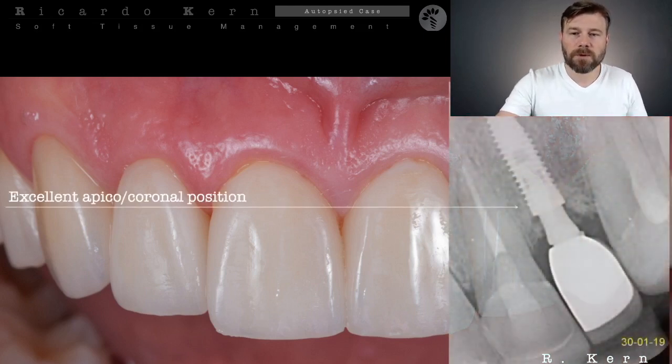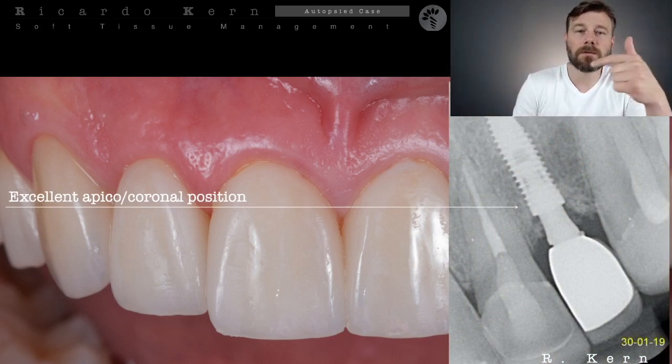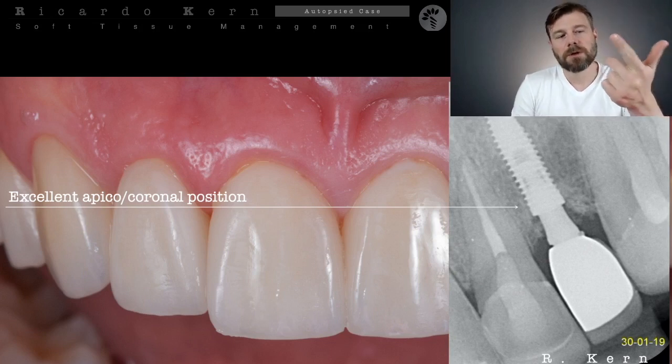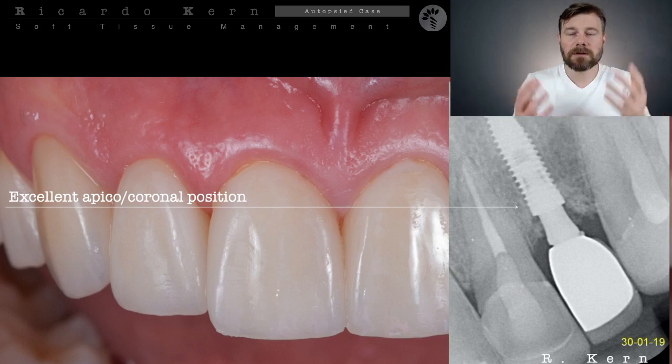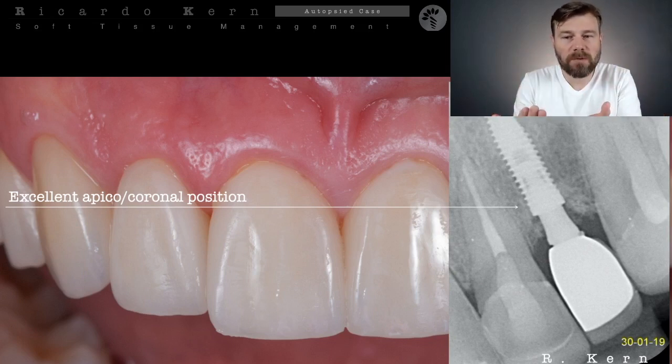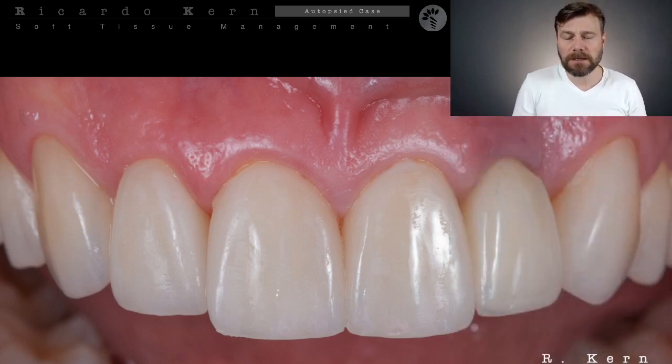So I'm going to prepare a little more toward the distal margin of these lateral incisors. Okay, good. X-ray evaluation: no bone loss around this implant, no peri-implantitis, no pocket in this area, probing a healthy tissue. I can really work in this environment that is very prone to give me a good result for my graft.